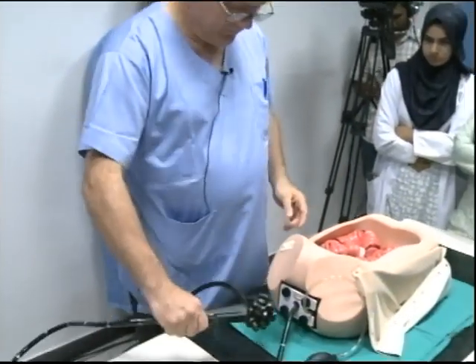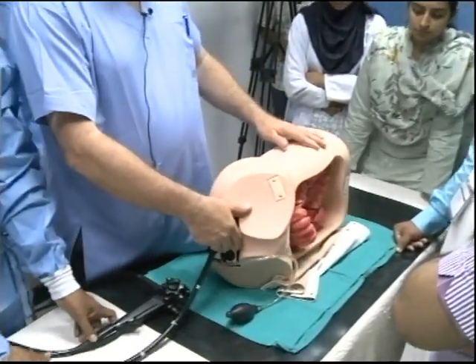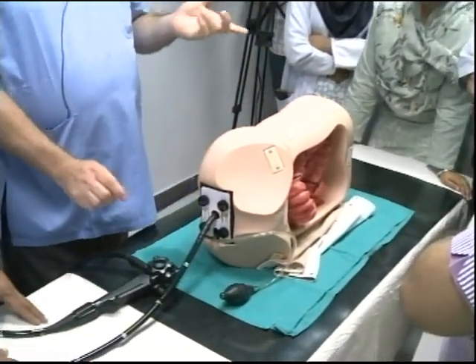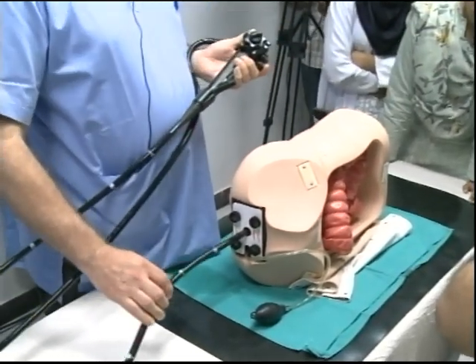So we've got a scope. We've got a patient. Patients, normally we start in the left lateral. Can you see the bowel? I put the air in. What's happening to the bowel?